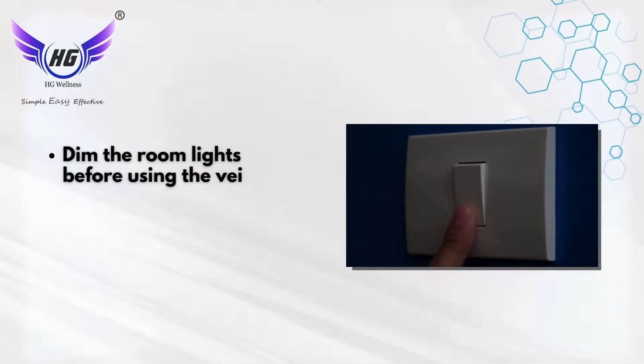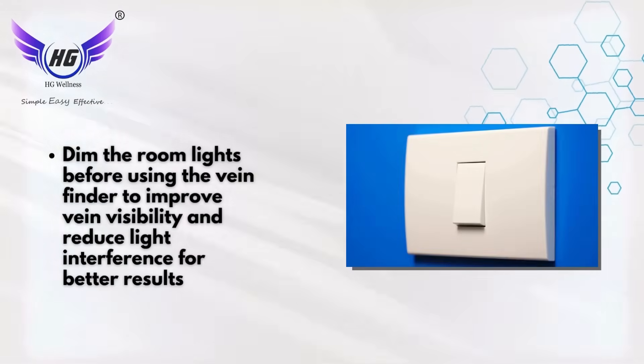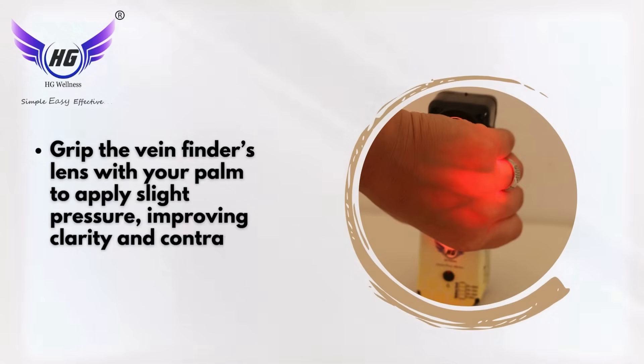Dim the room lights before using the vein finder to improve vein visibility and reduce light interference for better results. Grip the vein finder's lens with your palm to apply slight pressure, improving clarity and contrast.